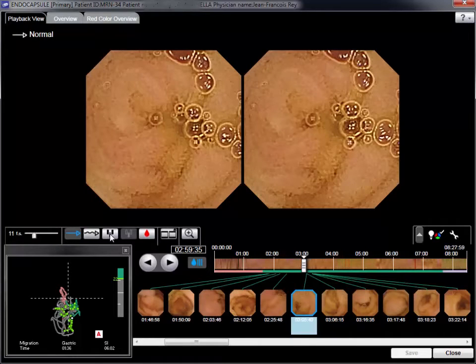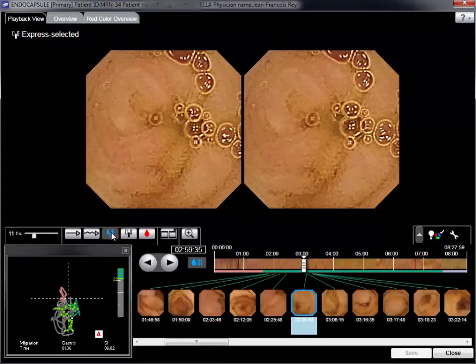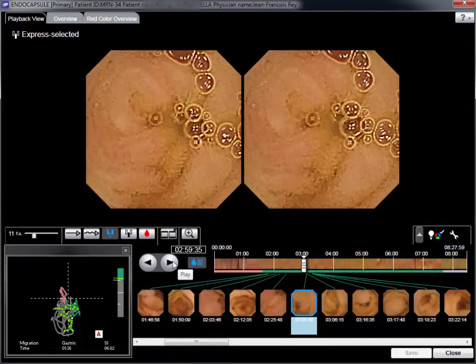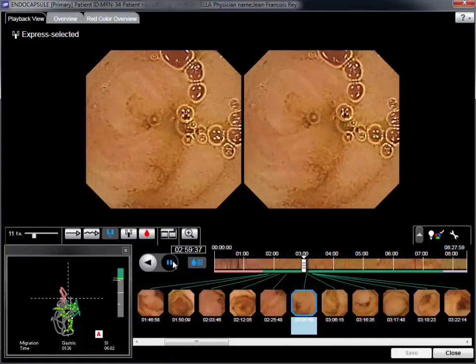In such cases, it is wise to review capsule images sequence by sequence, in order to avoid eye fatigue or loss of concentration.